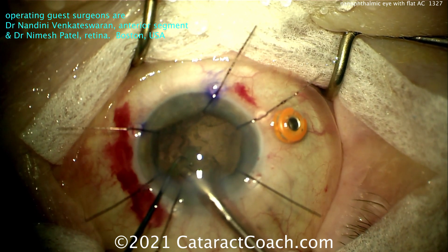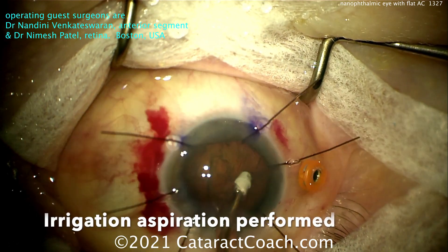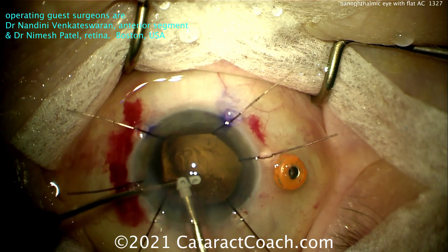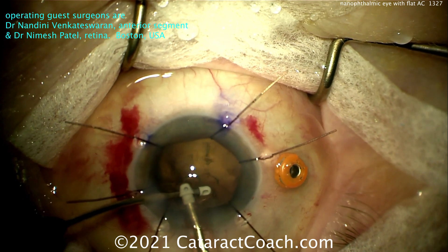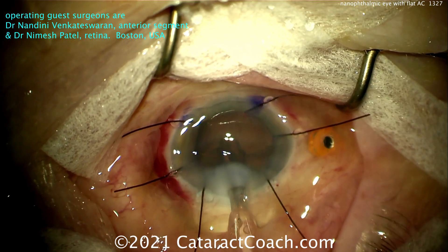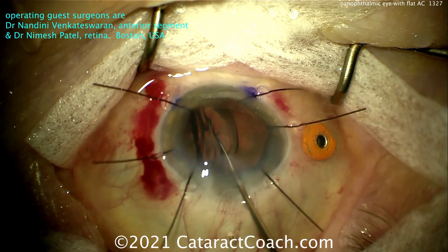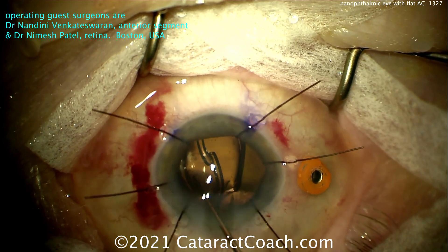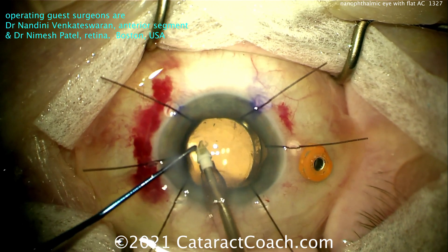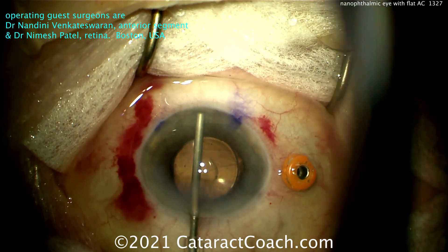Nice and easy, removing all that lens material — the nucleus is basically out. We're using a smaller sleeve here, looks like 2.2 or 2.4mm. Cortex removal coming up. For the lens, calculate however you want. In the U.S. you can get up to a 40-diopter single-piece acrylic on the Alcon AcrySof platform, and close to that — mid-30s — on the Johnson & Johnson and Bausch & Lomb platforms. I would not primarily do a piggyback lens here. So they're putting in a J&J lens, 29.5 diopters, right in the capsular bag, aiming for about minus one post-op. Why isn't the lens power higher? The patient had very steep corneas — 51 diopters in one meridian — so the lens power is going to be less. If the patient had a 19.8mm axial length but flatter corneas, you might need a lens in the mid-to-high 30s.